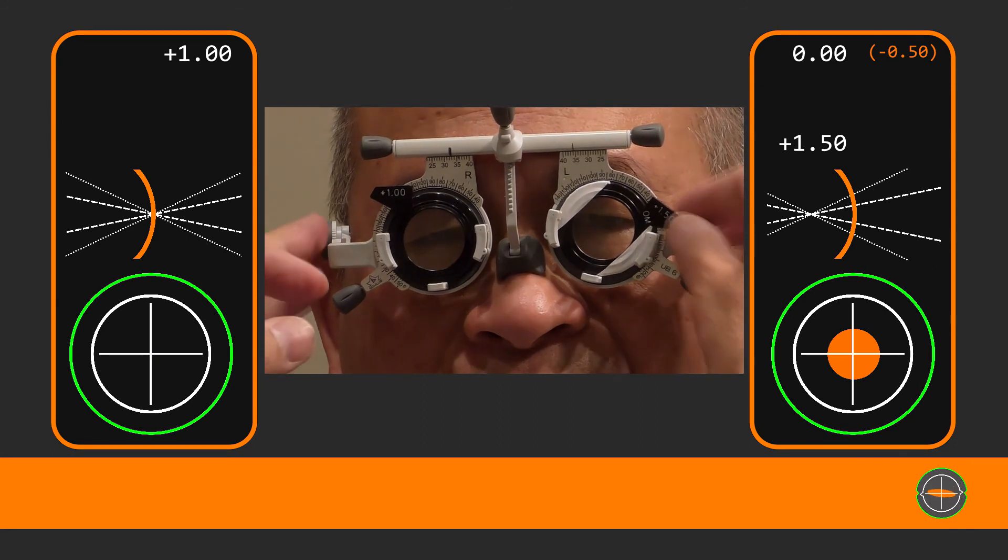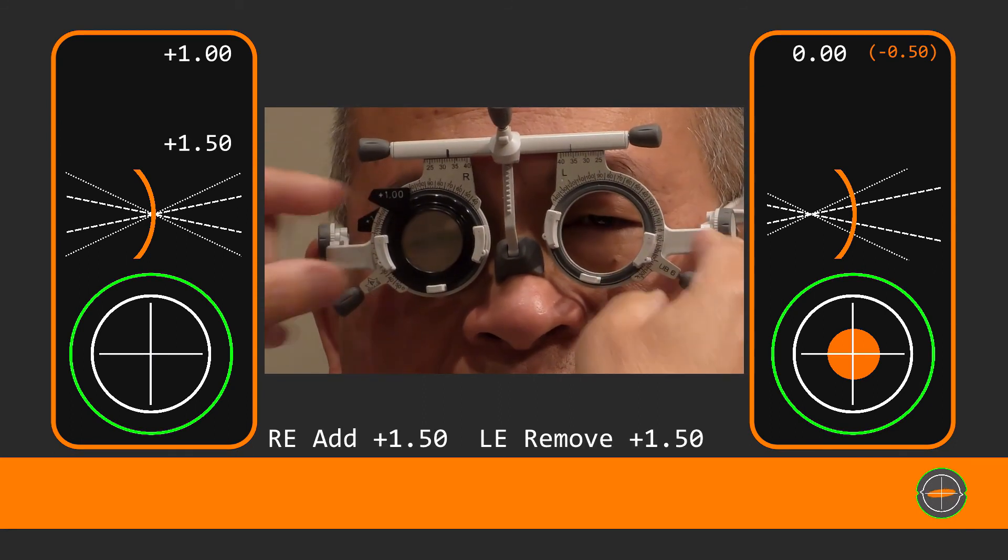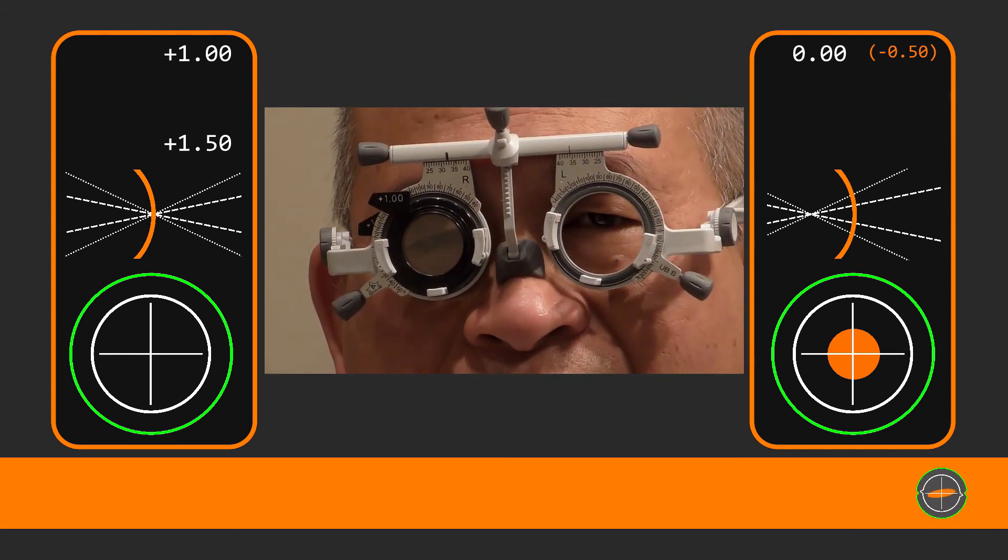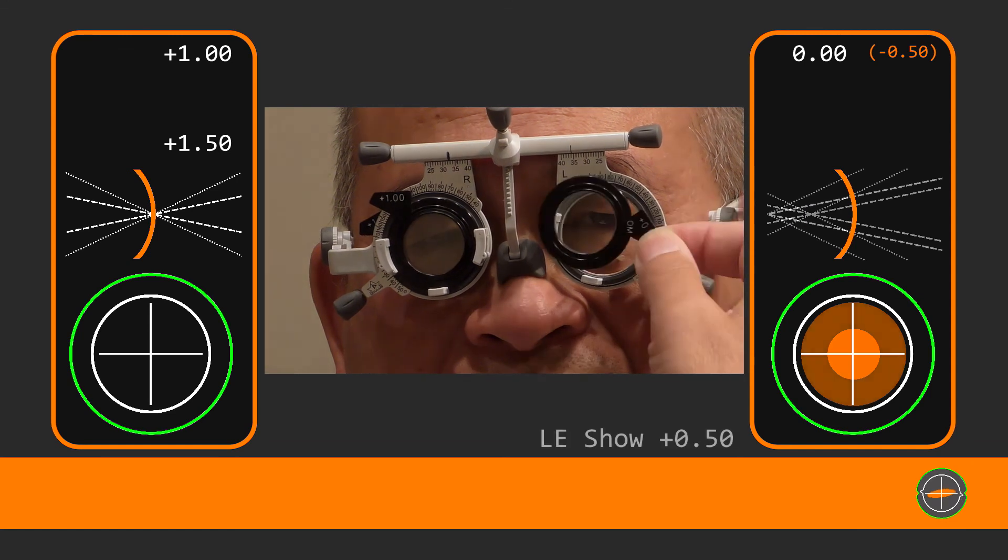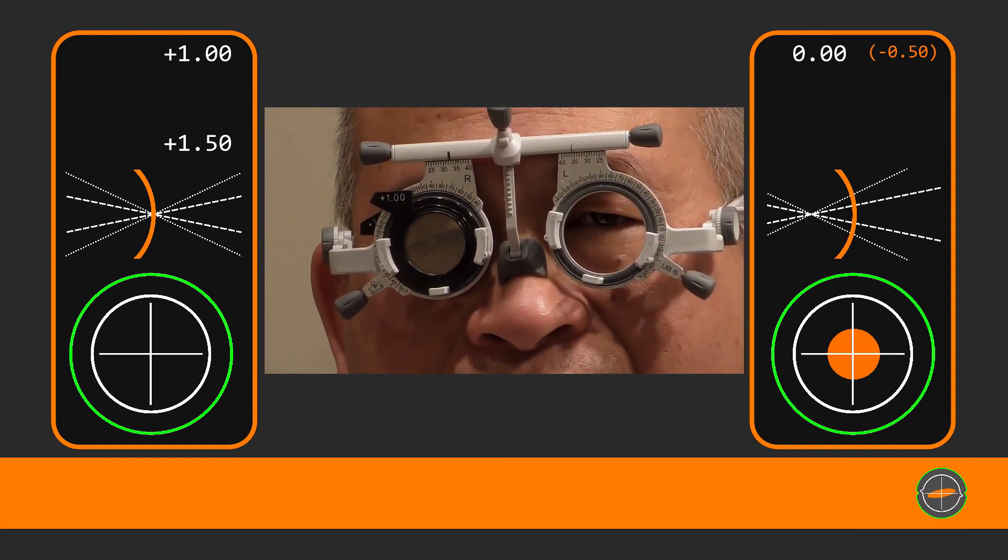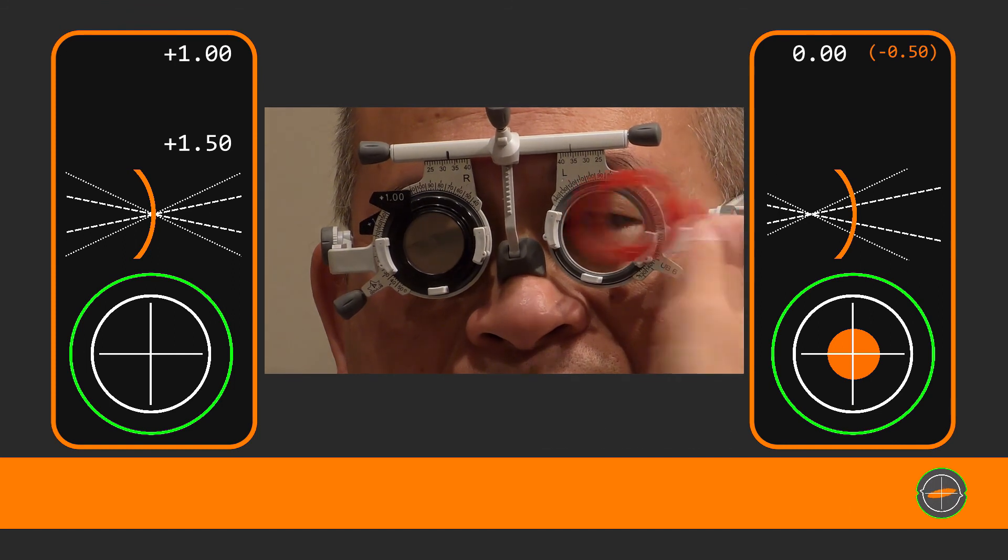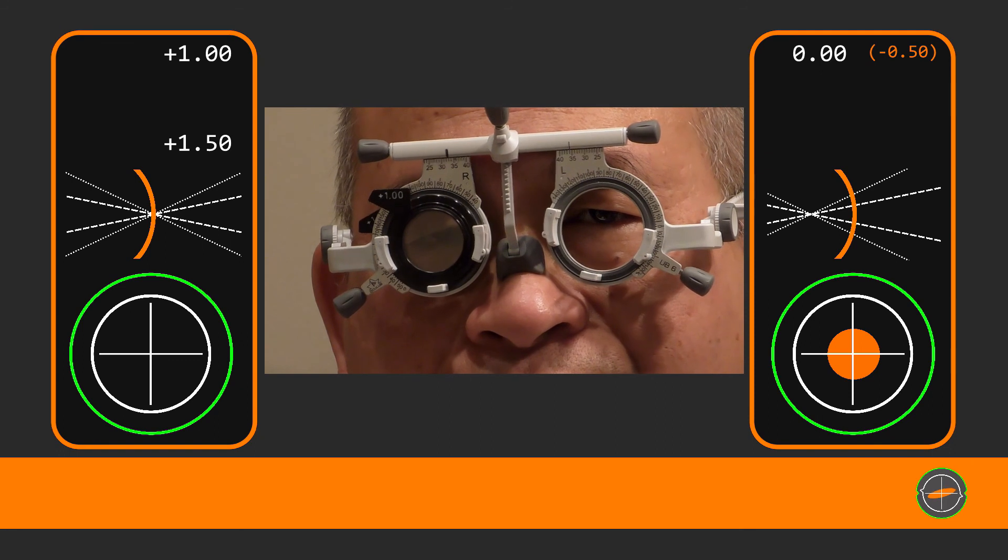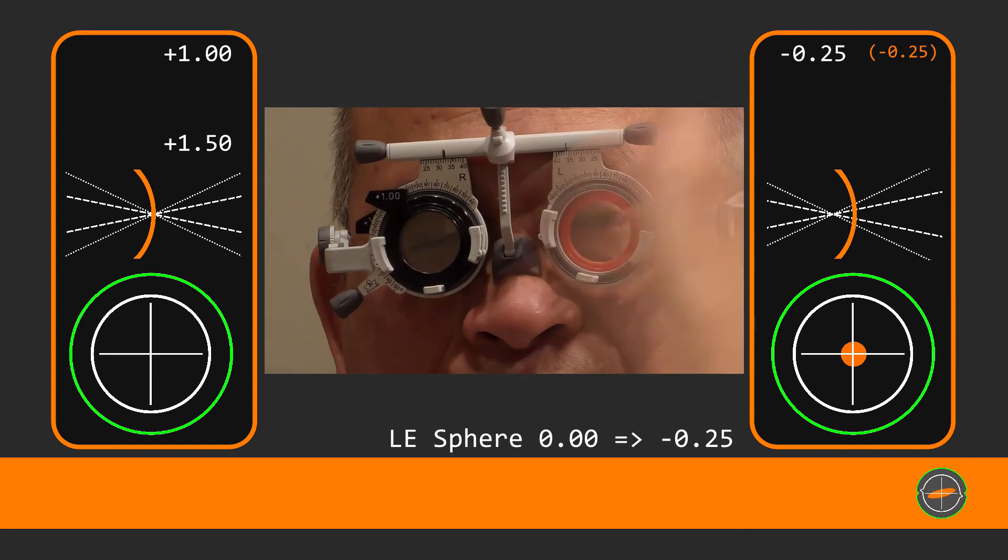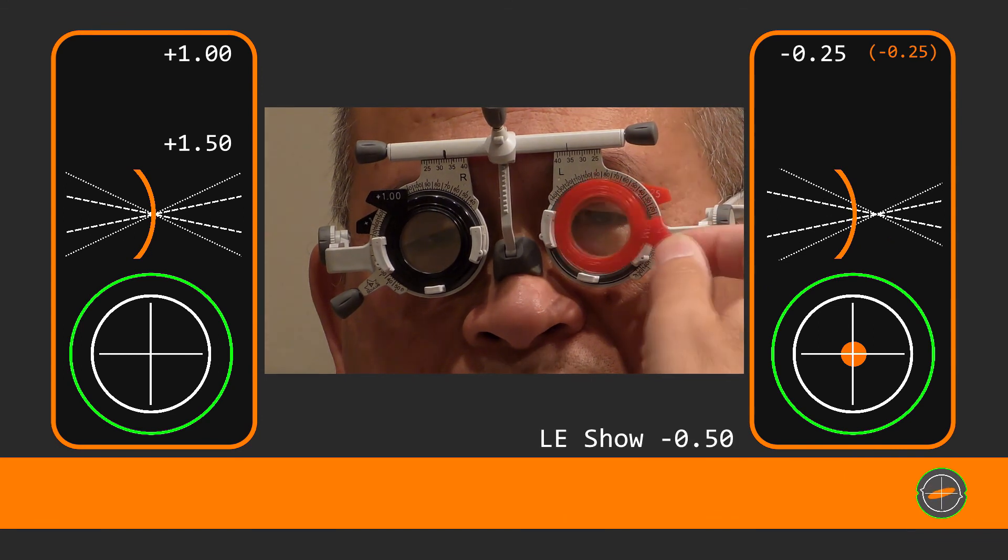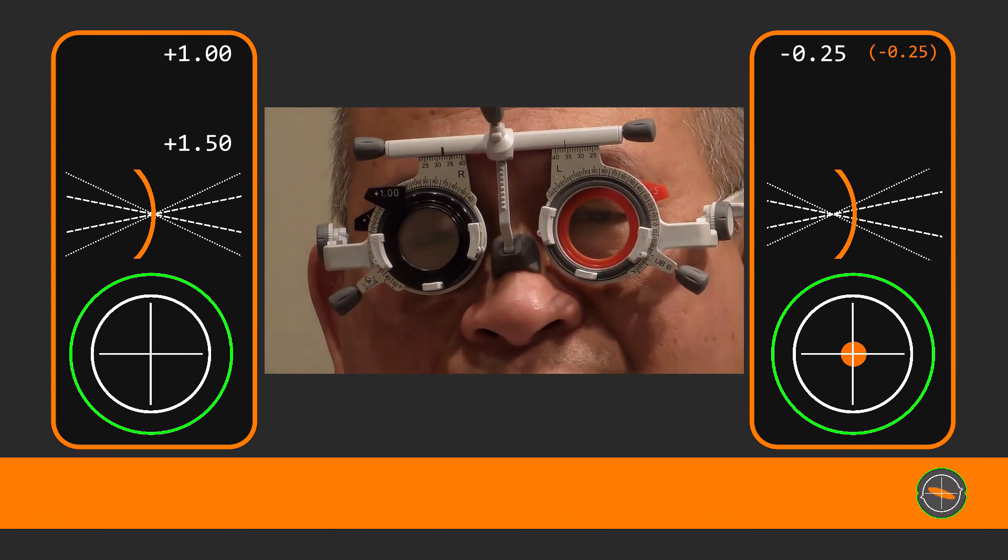See the quicker presentation. Now let's swap this lens over to the other eye now. And that's a bit blurry there isn't it? And keep looking at that line there. And better with this one. Better without. And better with this one. Better with. And better with this one or without? Better with.